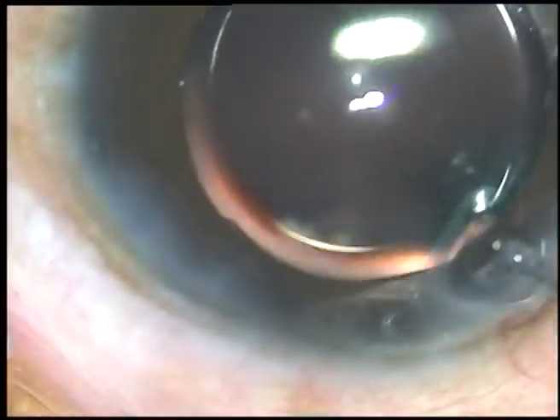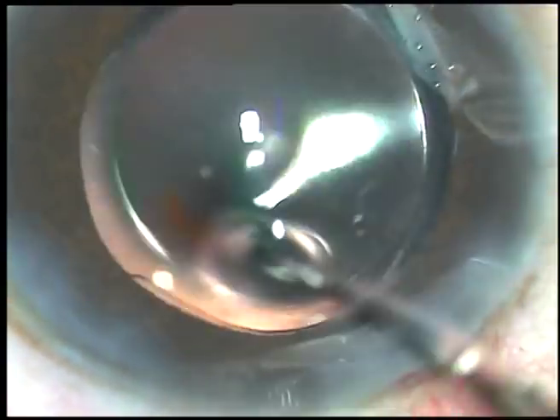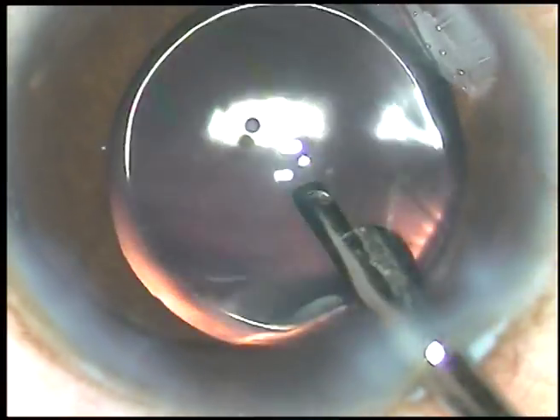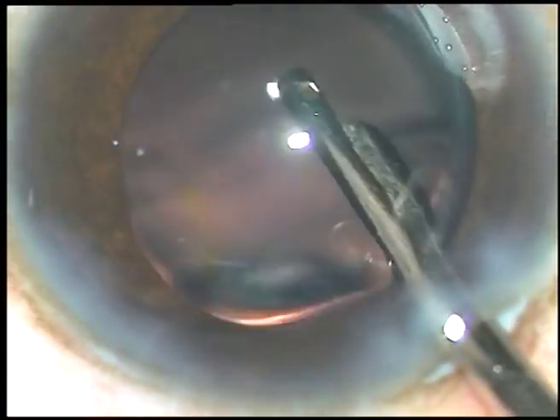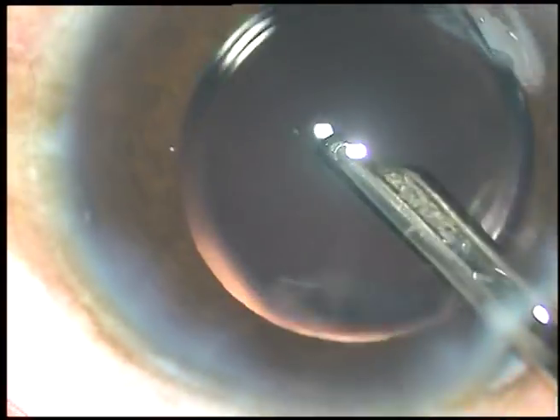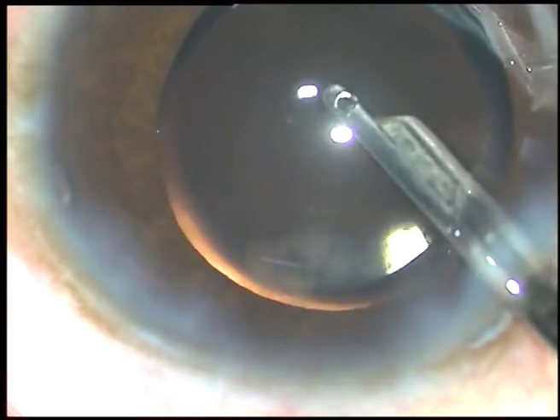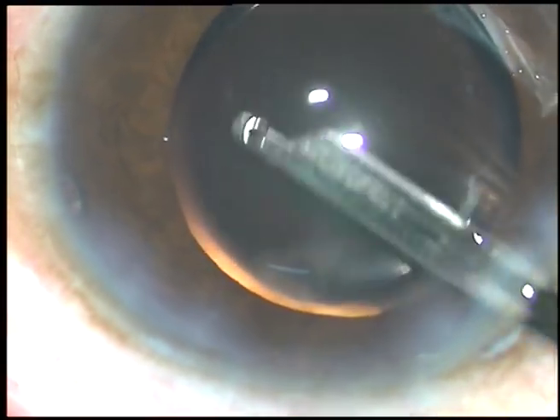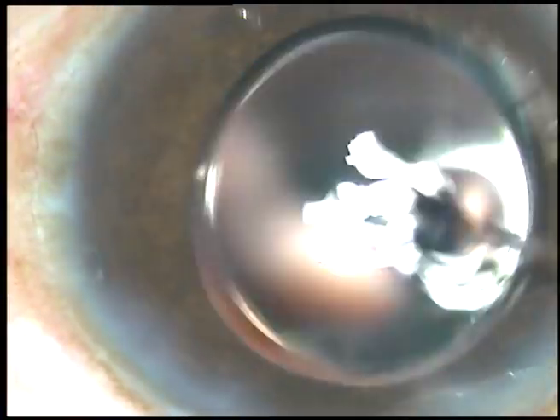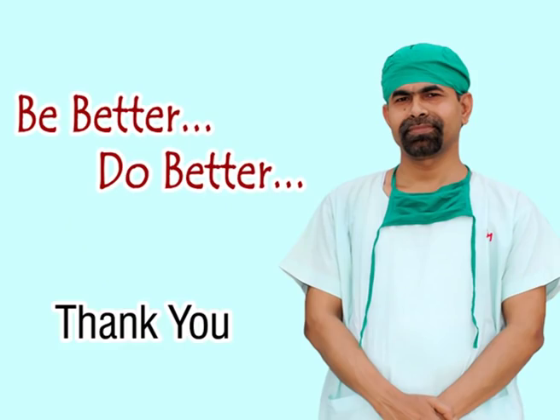Now the side port is hydrated and a final lavage of the anterior chamber is carried out. The anterior chamber is formed nicely and the case is concluded. Thank you very much for watching — you can try this lens tilt technique. Be a competent surgeon and do very good service to mankind.